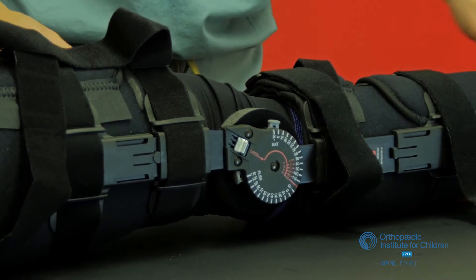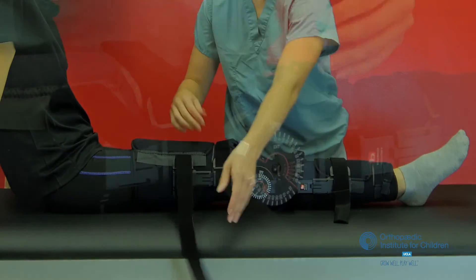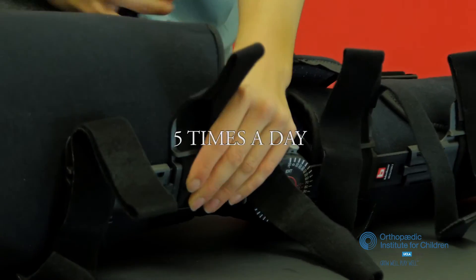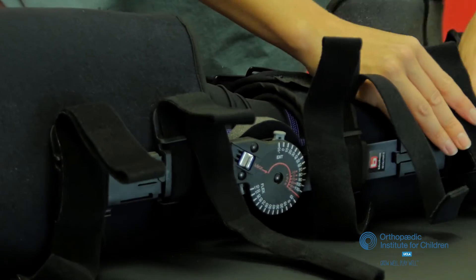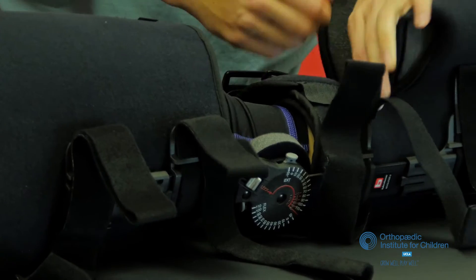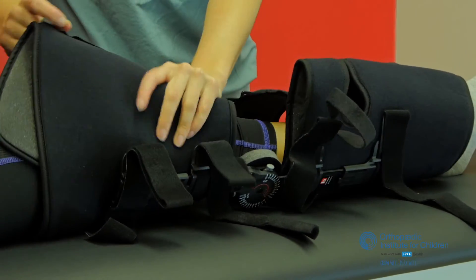This brace should fit nice and snugly, and again any adjustments can be made by yourself or in the office at your follow-up visit. Five times a day you should remove your brace. During this time, for about 20 minutes, you should be practicing the following exercises. As you remove the brace, if it's well fitting, you can go ahead and leave that metal hinged part attached to the foam.